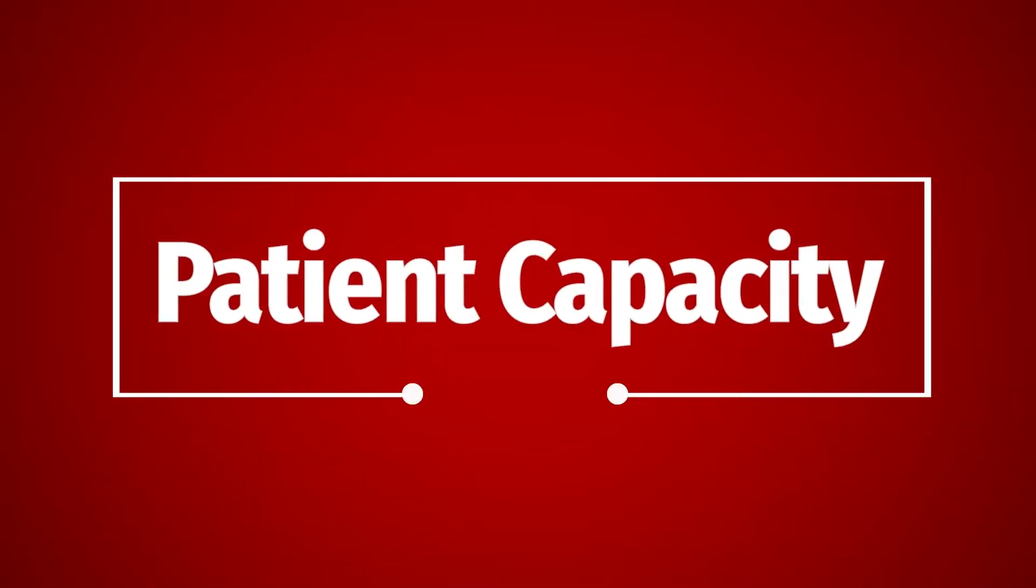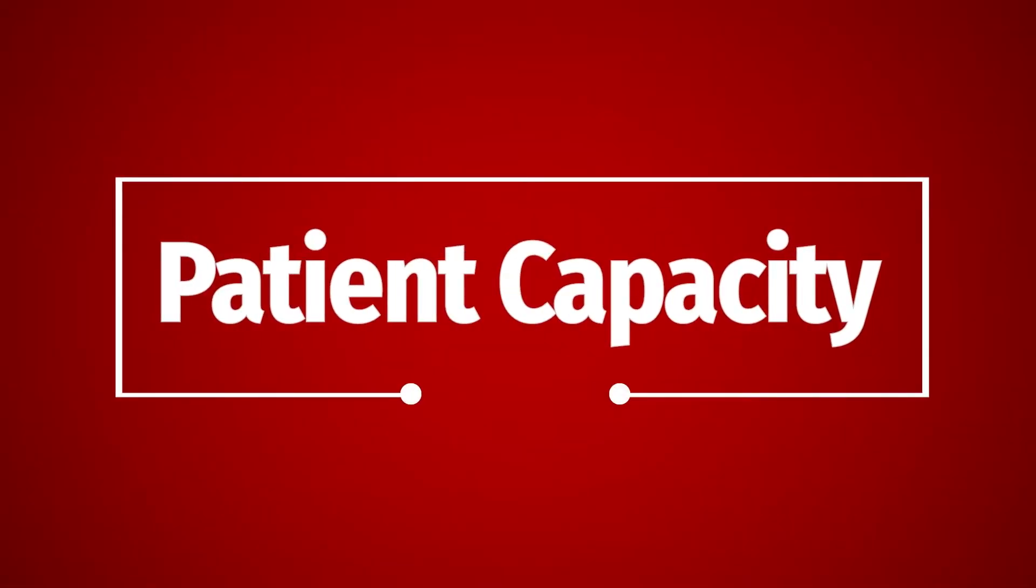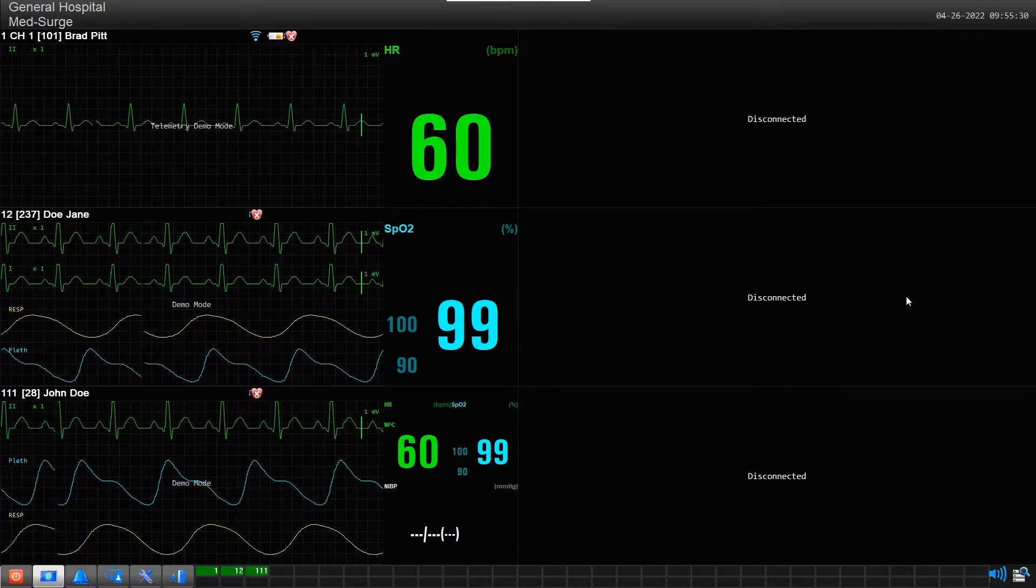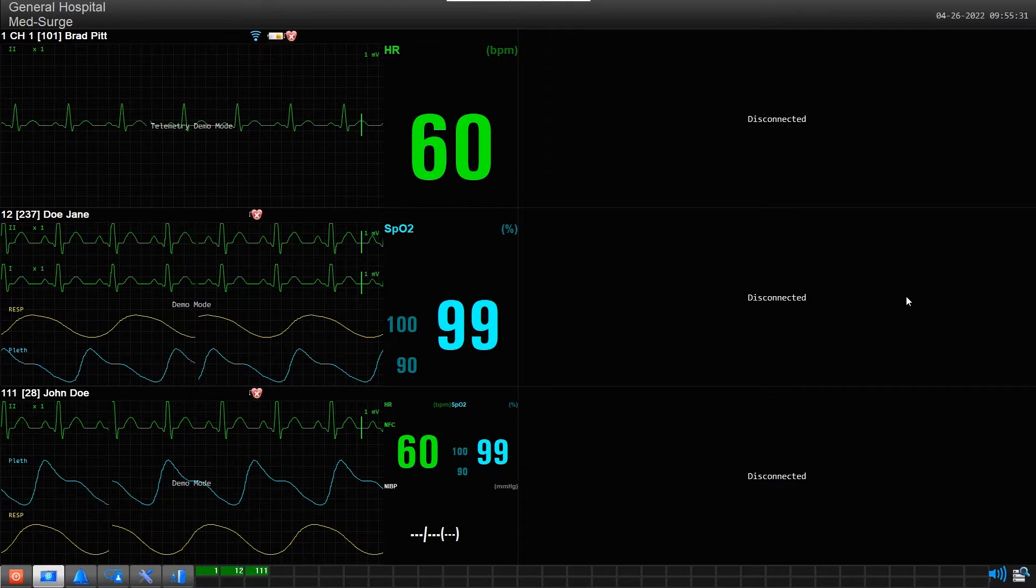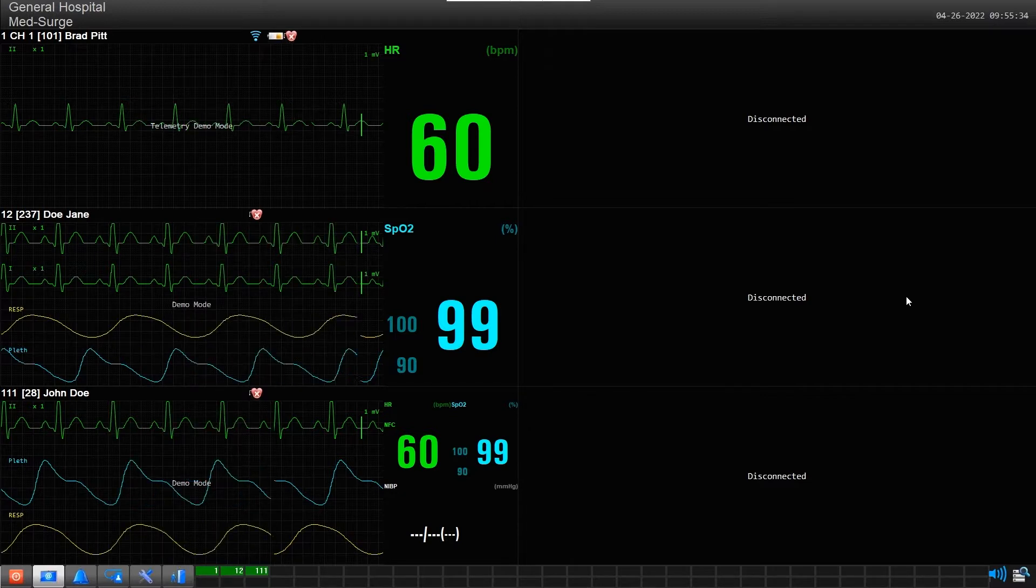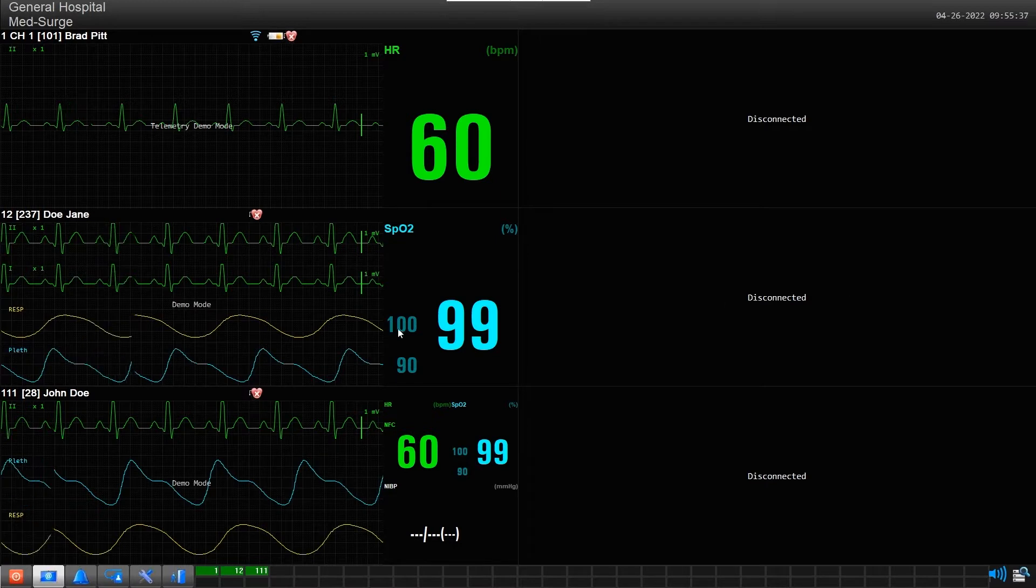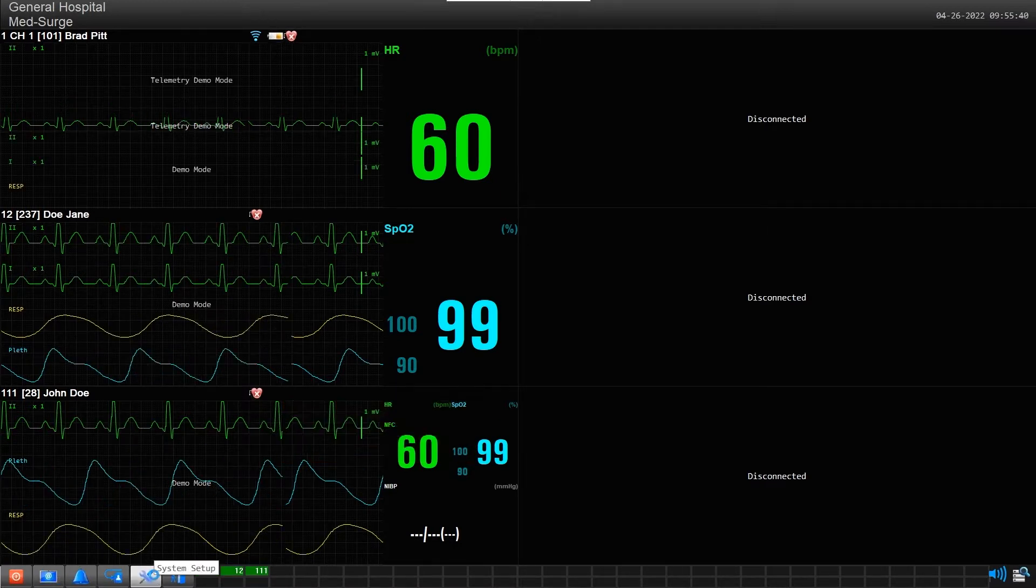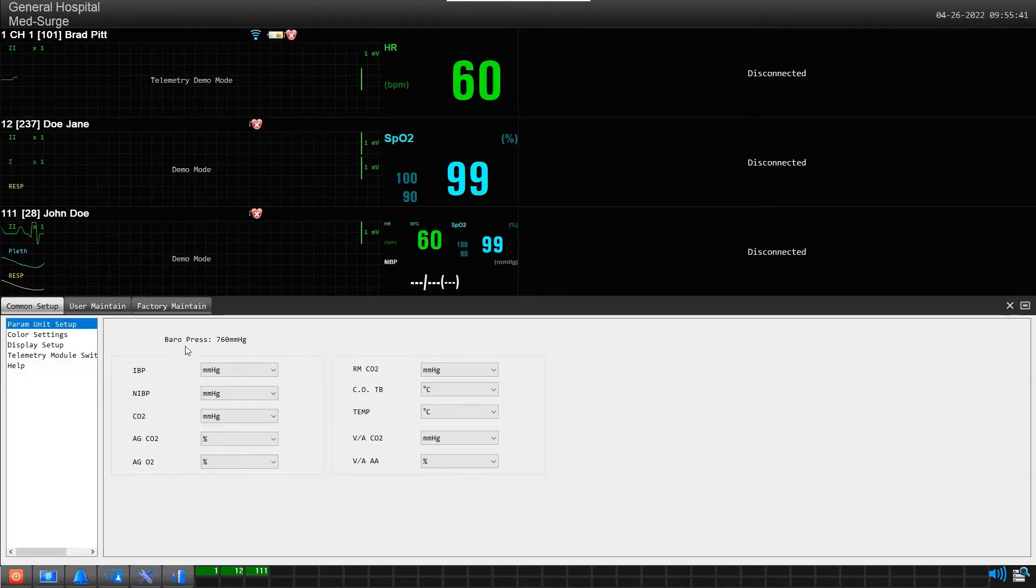Patient Capacity: The MFM-CMS is an extremely versatile central station with the ability to change its patient capacity based on need. You can change screen capacity by first clicking the system setup button located here, then choose the common setup tab in the next screen.